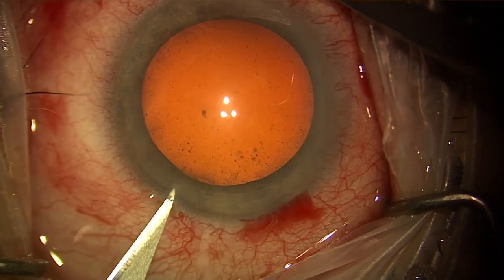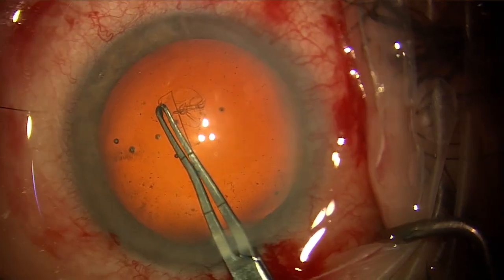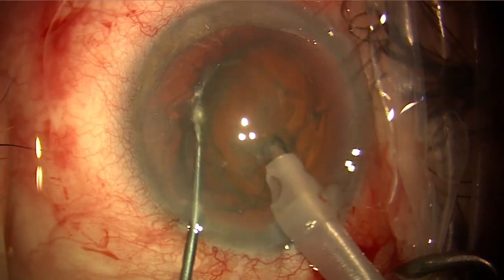So this first case is of a combined cataract and iStent infinite case in a patient who's a myope on 4 classes of glaucoma medication with a pressure of 15 millimeters of mercury, an ideal case for the iStent infinite. So we're just doing the phaco element here.